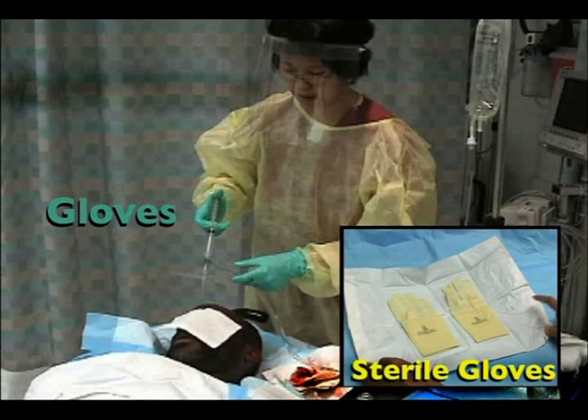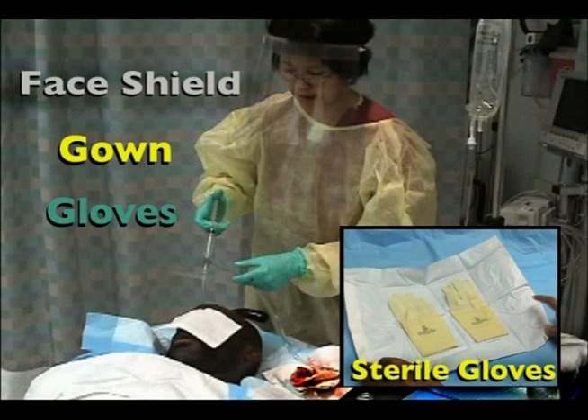Personal protective equipment for universal precautions includes sterile gloves, non-sterile gloves, a face shield, and a protective gown.